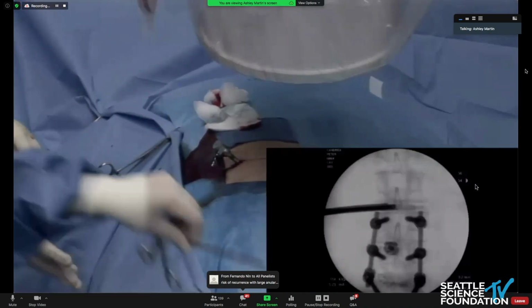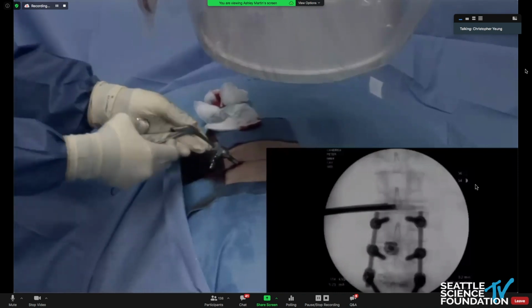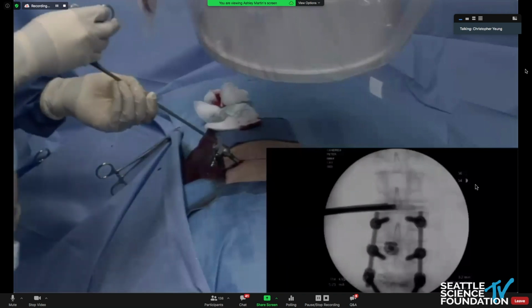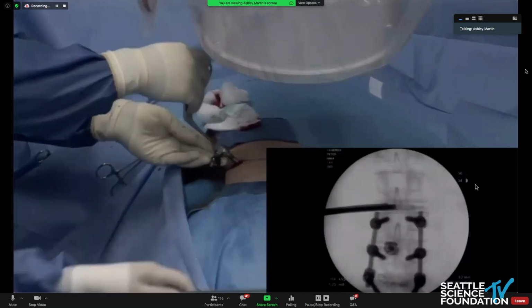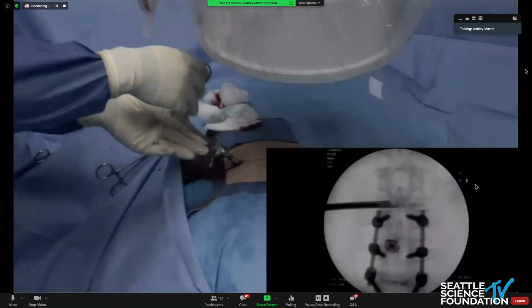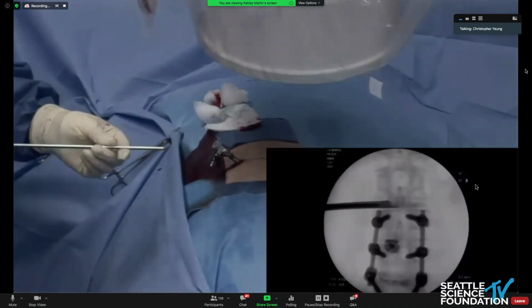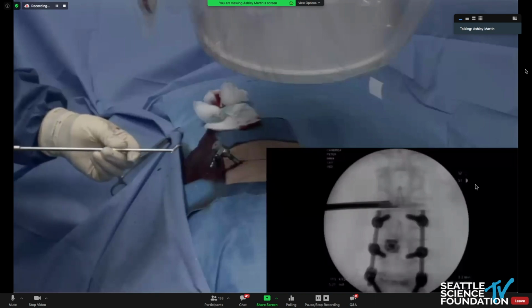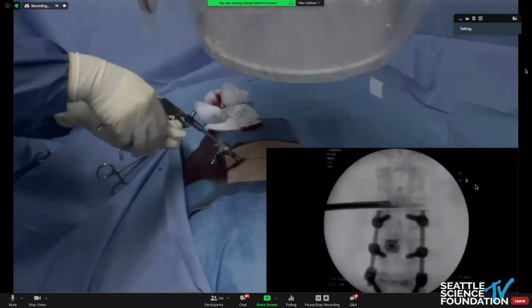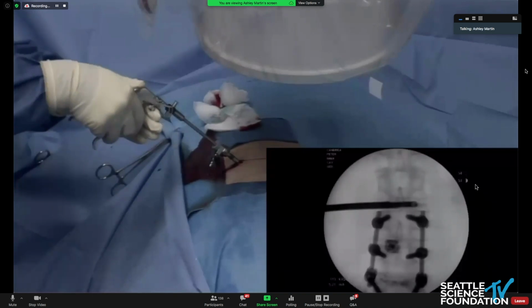Okay, give me the long fat, which is the longer pituitary, which gives you a little bit more reach. And then the next one will be this angled pituitary, which is fondly called the grabzilla. This is just reaching into the disc space. And so here, I'll show you how it works. See, right at the entry zone. And you don't want to do a total nucleectomy here. And here's the grabzilla. See how it articulates? Angled pituitary. Go in. It's got a nice design there.